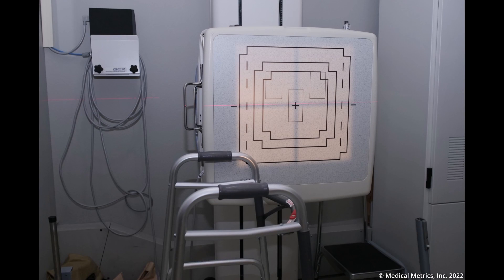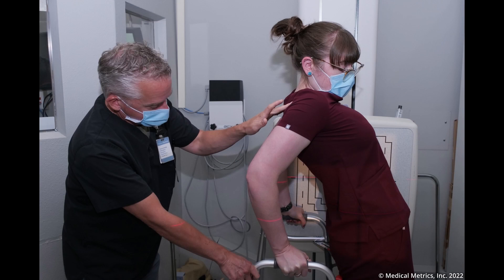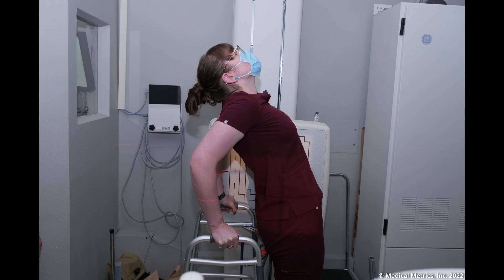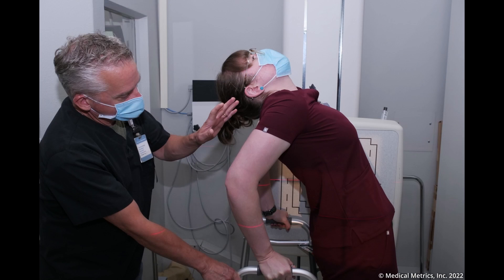Position the x-ray system for the extension radiograph. Position the patient in extension with the walker behind the patient. The patient can grasp the walker behind them for stability, which also helps avoid twisting or lateral bending. Center the beam on the iliac crest. The extension x-ray should allow visualization of T10 to the lower sacrum.